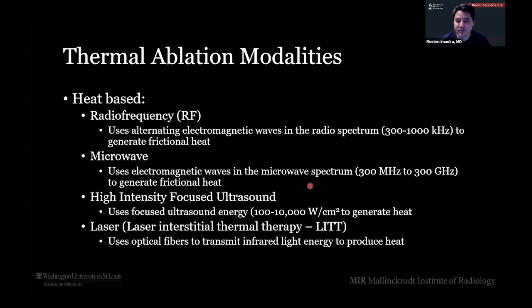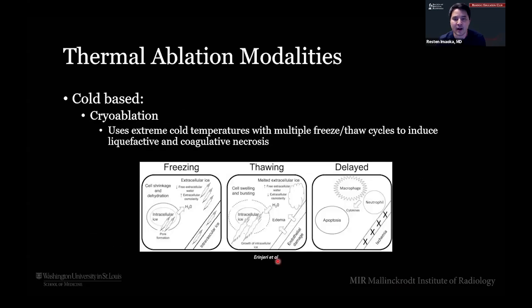This is now in the microwave spectrum. You can see 300 megahertz to 300 gigahertz. So much larger forces there. You also have HIFU, not too common, or laser, also not very common. And then if we're talking about cold base, cryoablation is what we're looking at there. So cold base uses extreme temperatures with multiple freeze-thaw cycles.